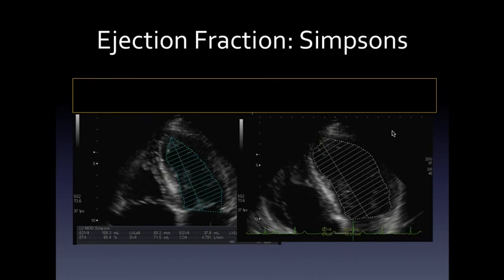The other thing about it is that the near field is very difficult in an ultrasound. So the near field is obviously where the ultrasound probe is emitted from. And this is the area that is often where the edge definition is at its poorest. And that's terribly important because if somebody has had an apical infarct, that's the very area of the heart where the regional wall motion abnormality is, and that's the area of the heart that's hardest to see, because the focal point of the ultrasound beam is generally a lot further down into the field, somewhere down around here.